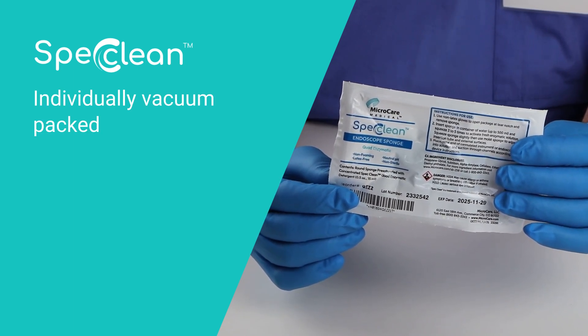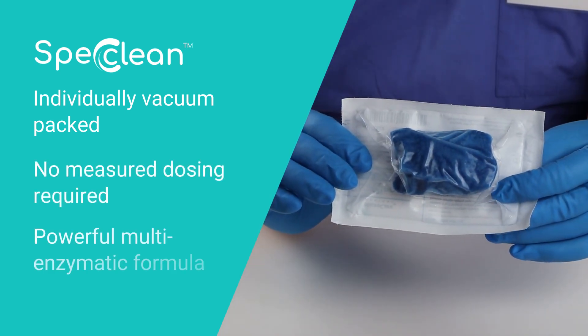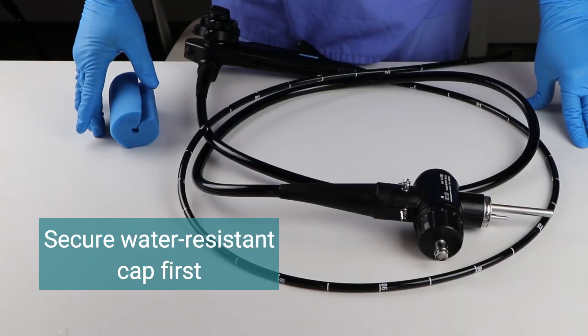It reduces time and effort following procedures. No measured dosing is required, and its powerful multi-enzymatic formula immediately starts cleaning to prevent dried-on soils.